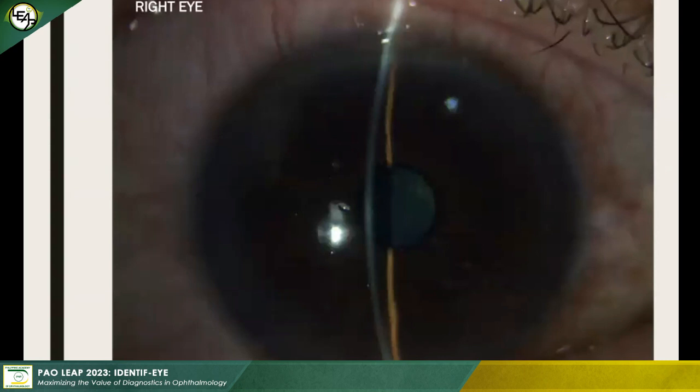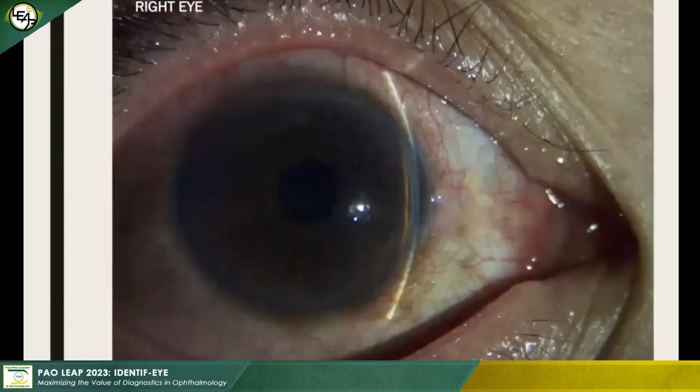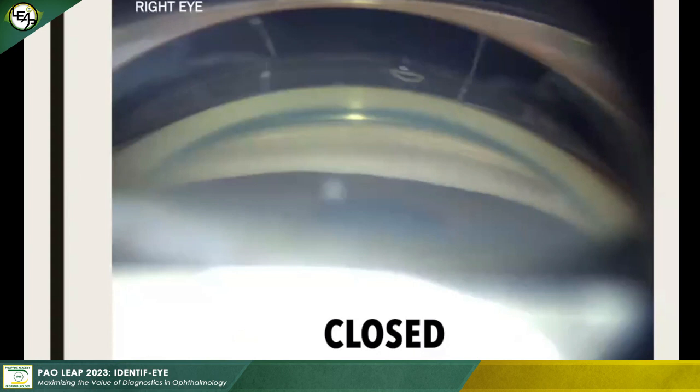Notice a shallow anterior chamber with a convex iris plane, and notice that the peripheral chamber is also very shallow. You examine the nerve, it's only mild cupping. On gonioscopy of the right eye, again, the lens is superior, so we are actually looking at the inferior angles.